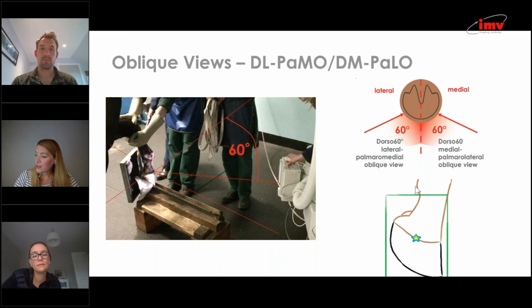So that's just demonstrated by this image here, which is fine if you're coming from this angle, like in this image. So this looks like the left limb of a horse. So this is a dorsal, actually, I think it's the right. I think this is the right limb of a horse. So this is a dorsolateral oblique.